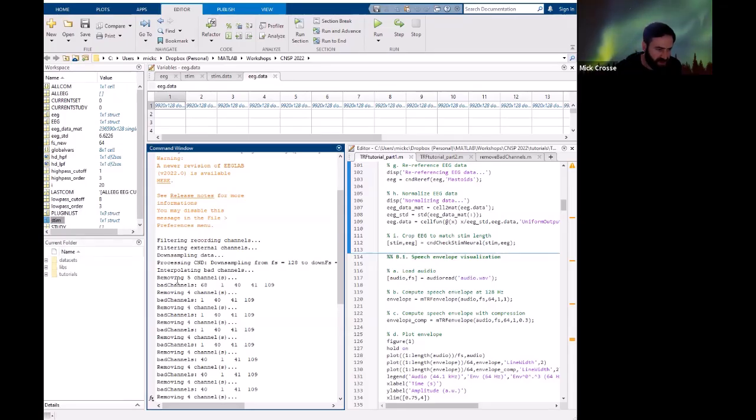So you can see it identified 5 channels that were bad. We've got 128 channels to work with, so throwing away 5 channels is nothing. That's fine. The rule of thumb you'd normally work with is, if it's anything more than 10% of your channels, you'd want to rethink either whether it's a good data set, or whether the criteria you're using to identify bad channels is not strict enough or too strict.